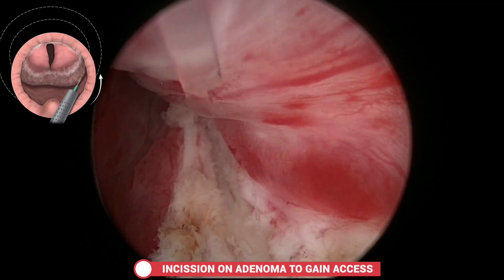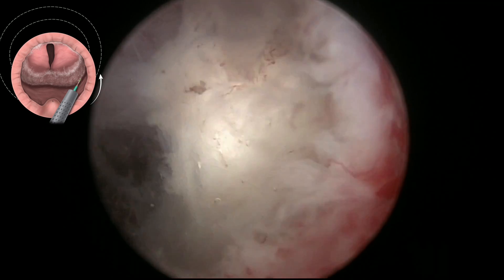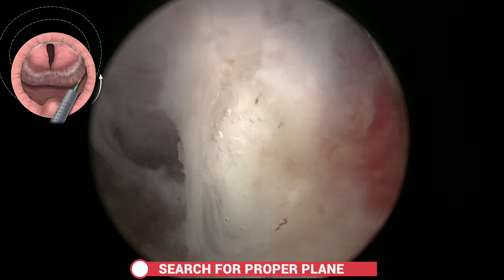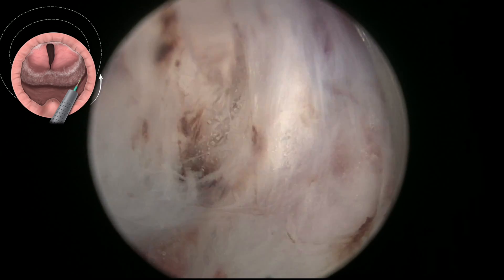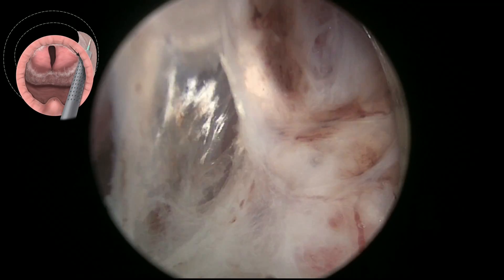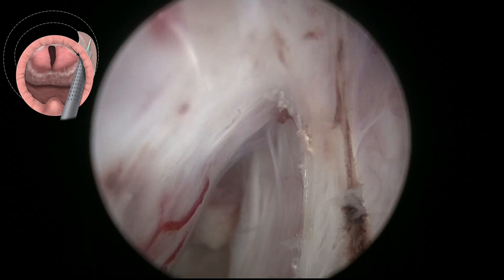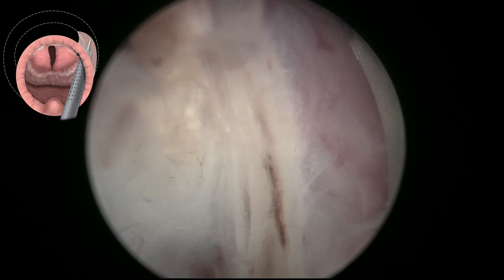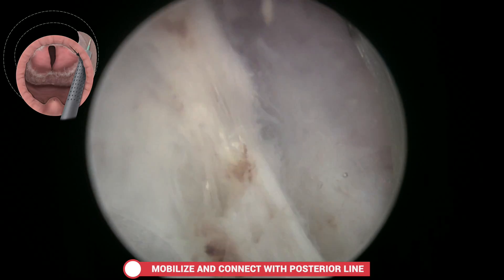Initially an incision is made to deepen the white line, which gives us access to find the anatomical plane of the lateral aspect of the prostate. This plane has to be taken towards the bladder neck to mobilise the apex, and it has to be ensured that this line will connect with the previous posterior line.